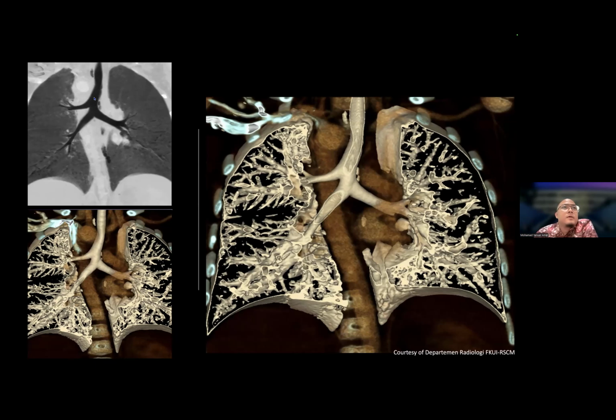That's why we need to report the range of this tracheal bronchus from the carina, because when they insert the endotracheal tube near the carina, this lobe will collapse or have atelectasis. So that's why we need to inform about this anomaly and about the range of the tracheal bronchus from the carina also.